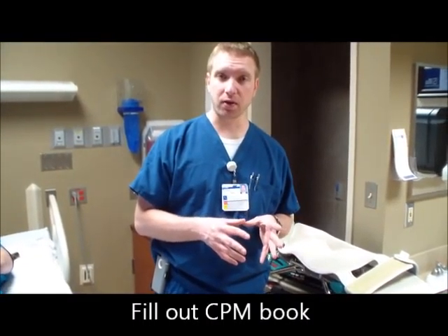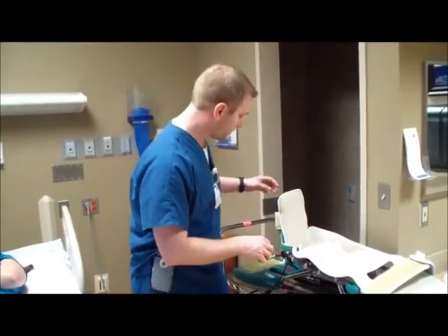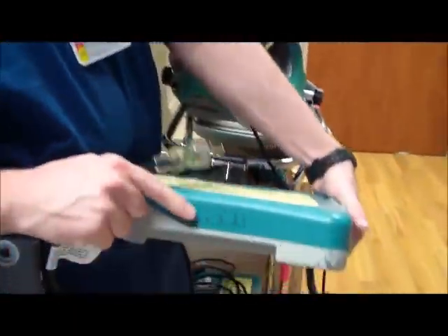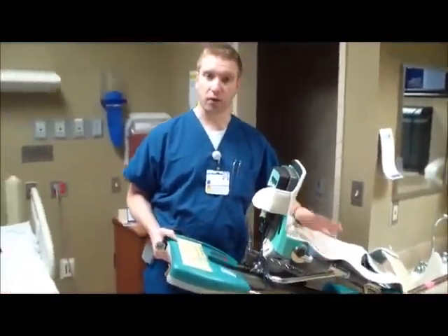Then there's also the CPM book. This is a book that is kept down in our department. You're going to want to keep an extra sticker as well, so you need a total of 2 stickers, one for the slip, the other one for the book. In the book, you'll go down to the department, put it in there, and select whatever CPM device you have. So our CPM device here is S21, and we're using one soft good.